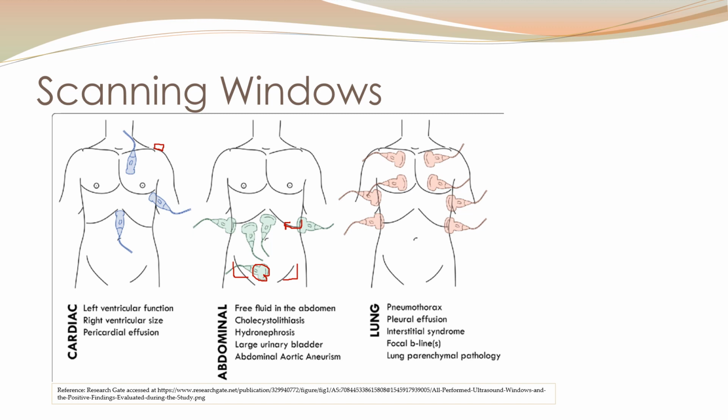A lines are like an artifact. When I put a transducer about this region, right in the lower pleural space, just above the costophrenic angle here, and I took an image of the lung, it would create this artifact, and the artifact would make it look kind of like an A with different rungs down a ladder. And that would indicate that it had normal aeration.